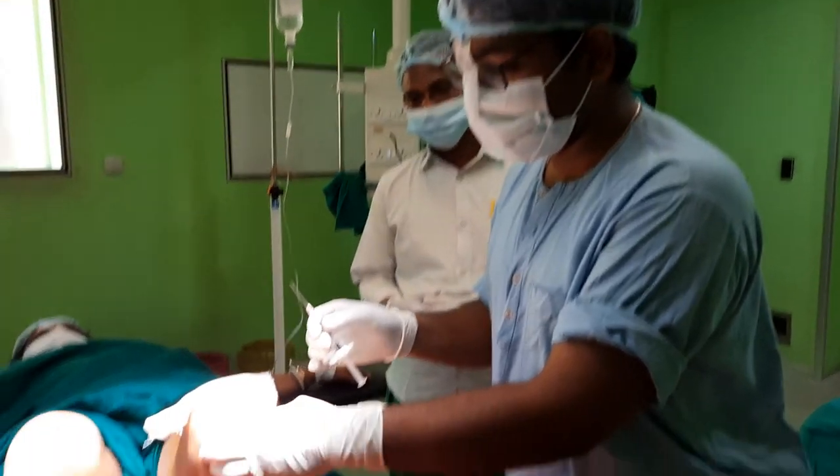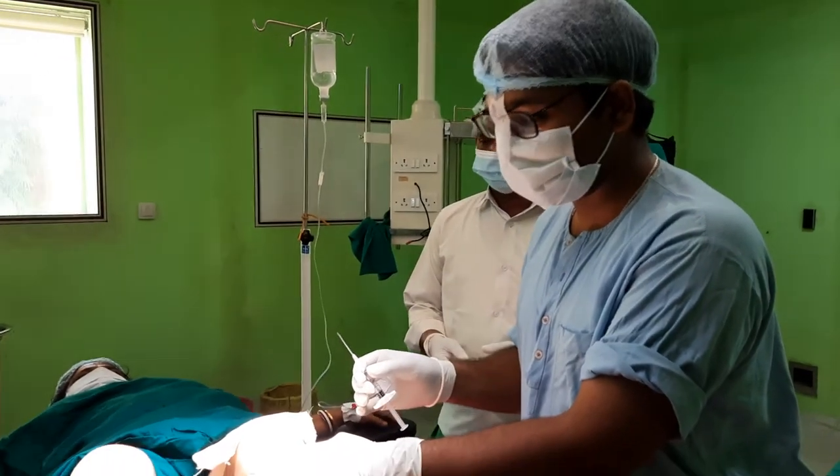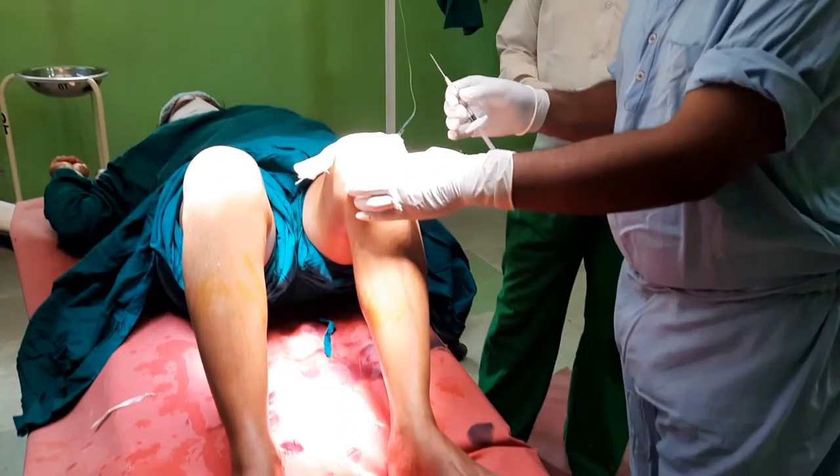I have loaded the injection and positioned the patient properly — that is, the knee flexed — and antiseptic dressing and draping of the patient has been done.